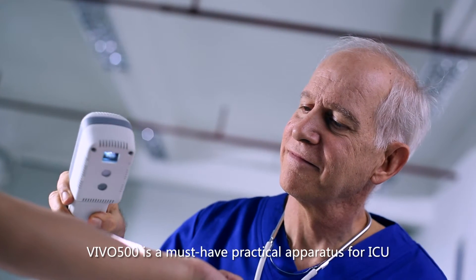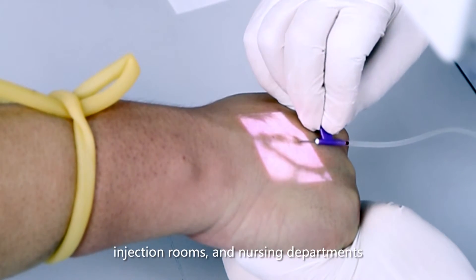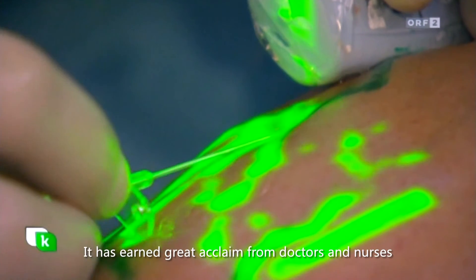VIVO 500 is a must-have practical apparatus for ICU, injection rooms, and nursing departments. It has earned great acclaim from doctors and nurses.